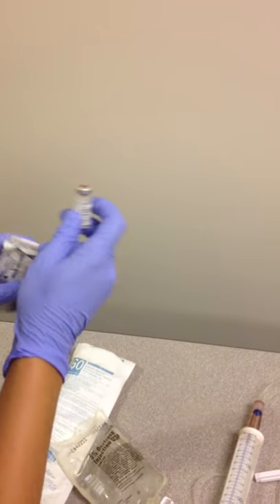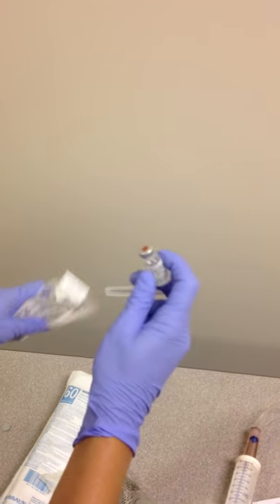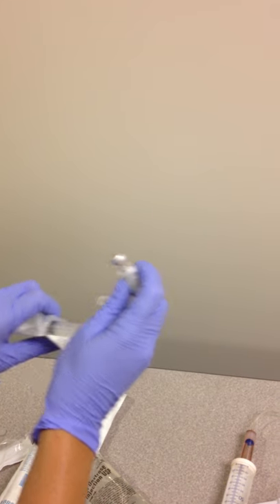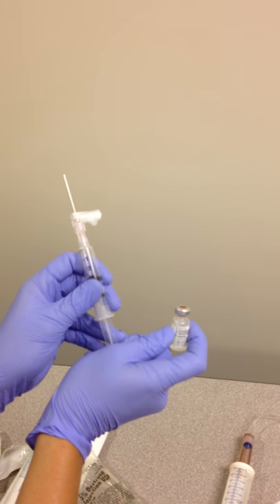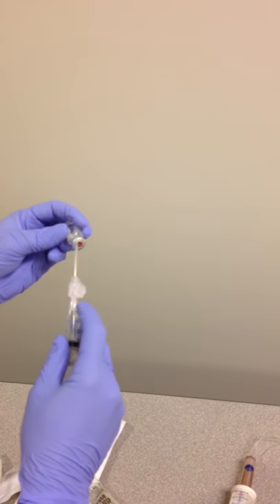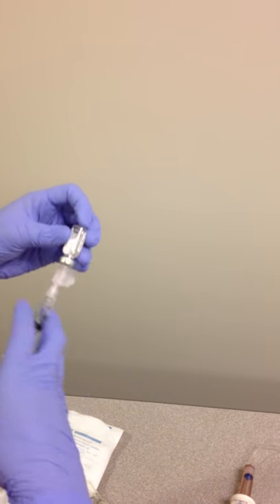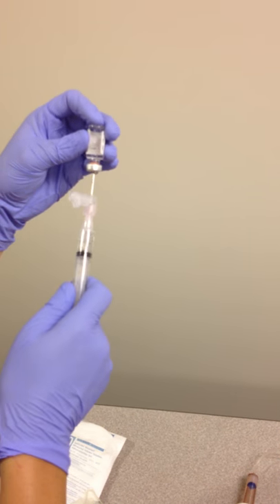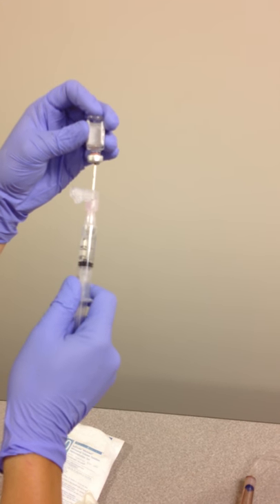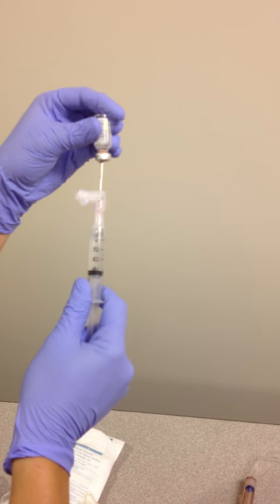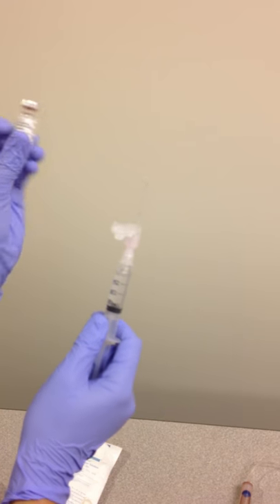Draw up the amiodarone as you would any medication. There's three milliliters in here. That's 150 milligrams in three milliliters.